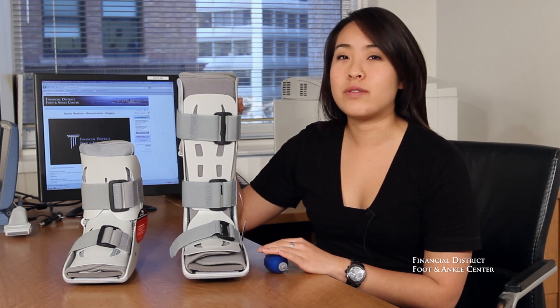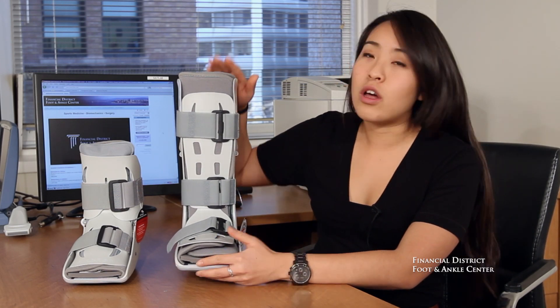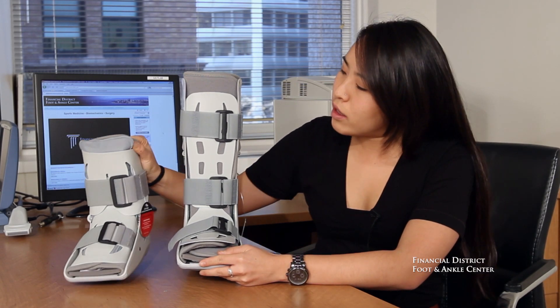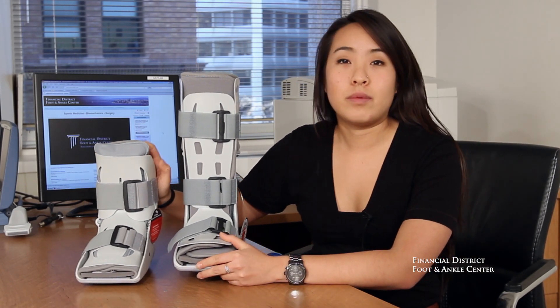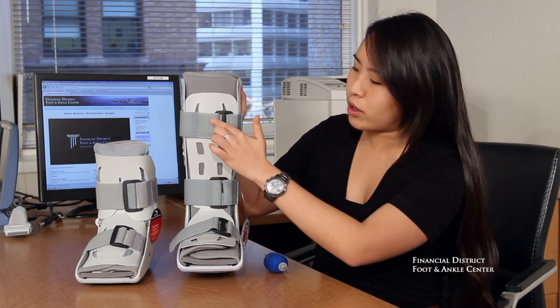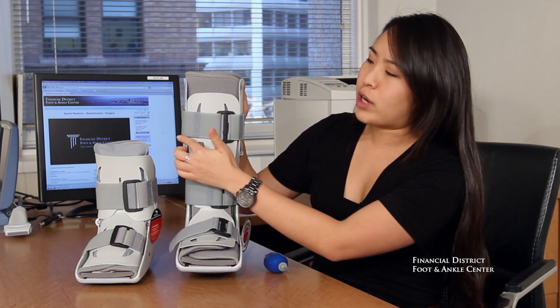For those of you who have seen the short leg air cast, the long leg one is very similar except for a few different key things. First, the most obvious you can see: the long leg air cast comes up just below the knee, whereas the short leg only comes up to the calf. Another difference is that you have a third velcro strap up at the top.